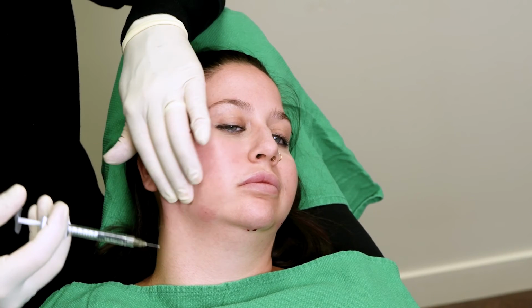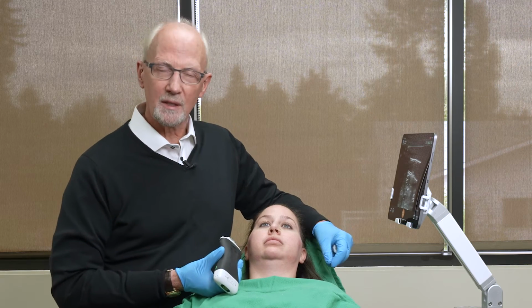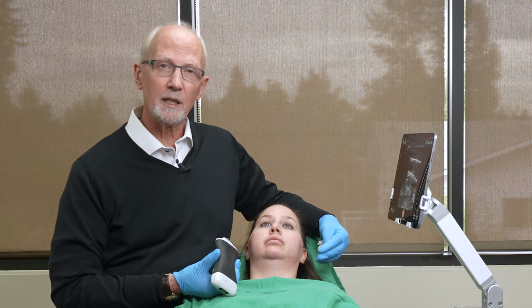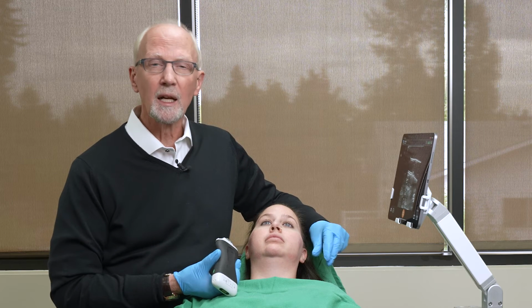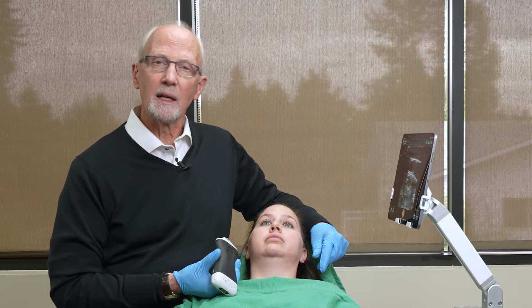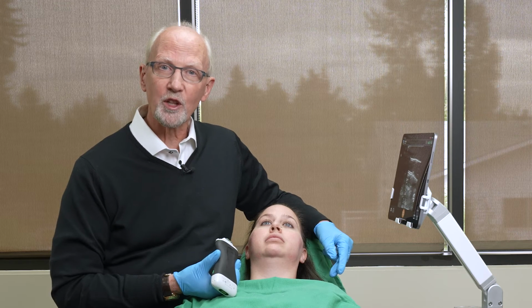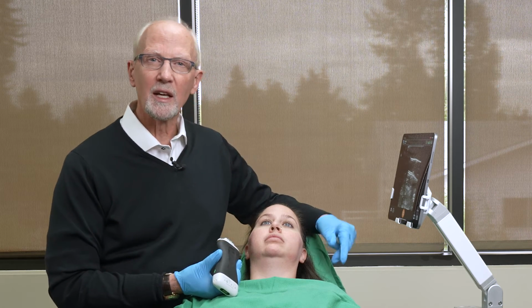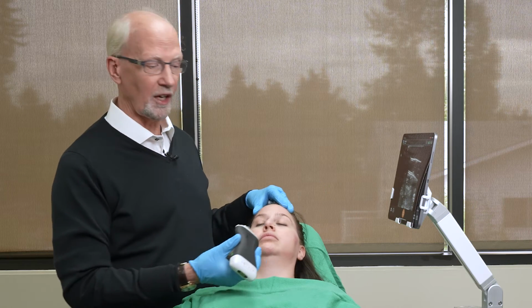cc's on each side. We've done 6 syringes of filler in a variety of areas, looking to lift and re-drape the skin, produce some foundational changes, and correct some contour. Now we're going to look at the product that we placed and see how it appears underneath the skin once we look with the ultrasound.